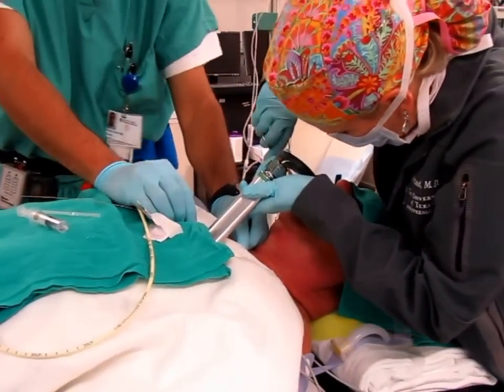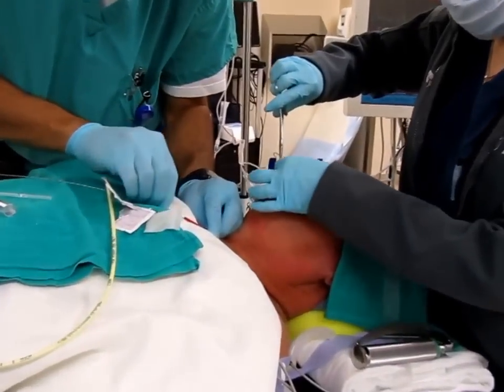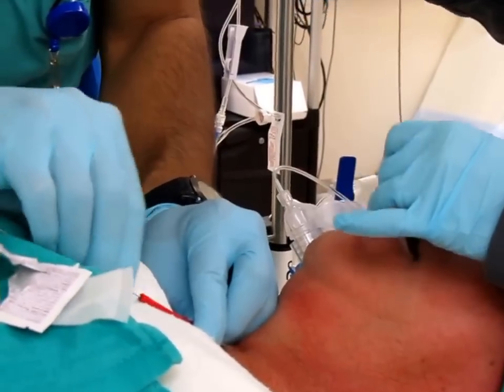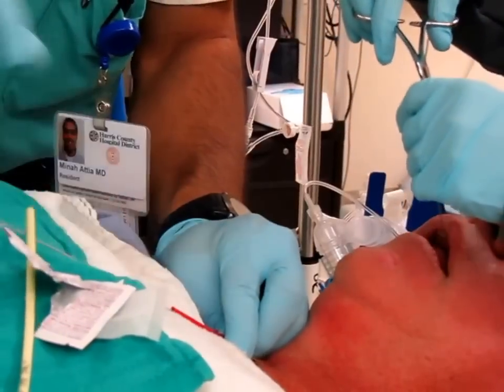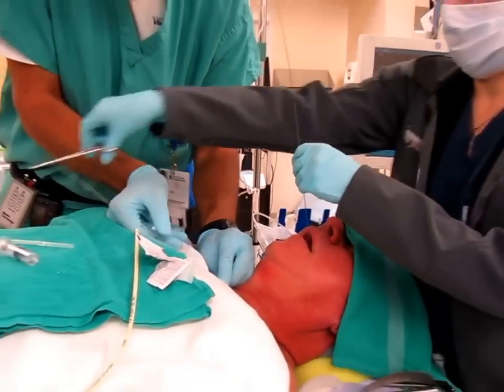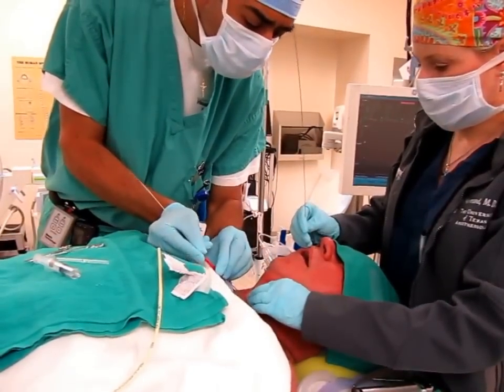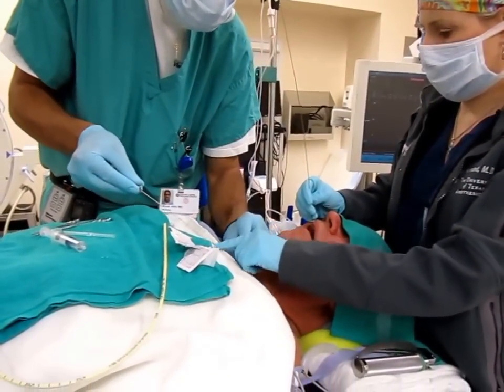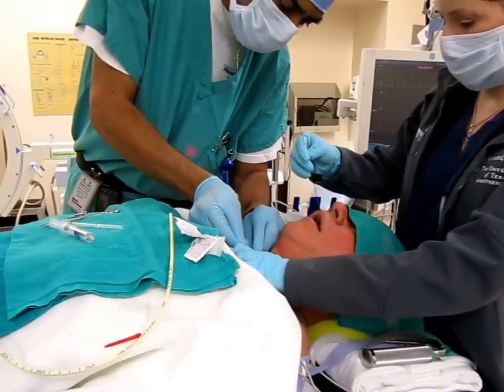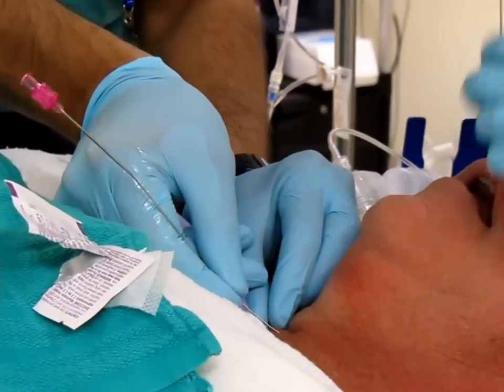Now you push — push it all the way through — and you're going to see that black second black line going all the way through. Push, push, push. Take your needle out and advance to the black line, just a centimeter past. Keep pushing. There's the black line — just advance just a little bit past so that we can see it.